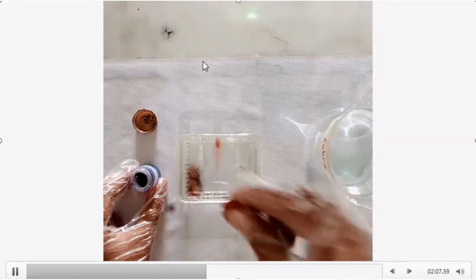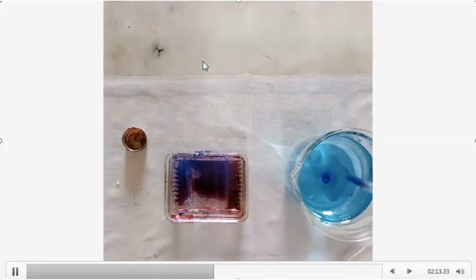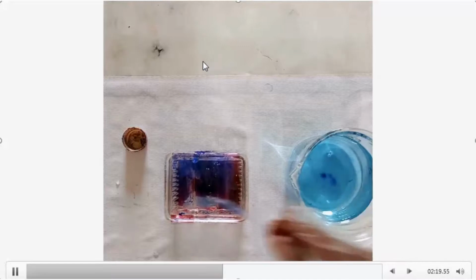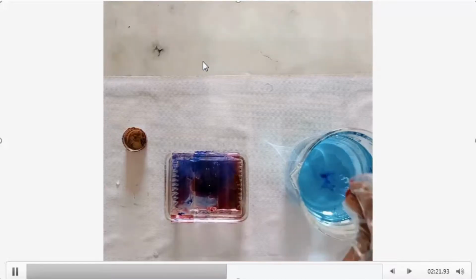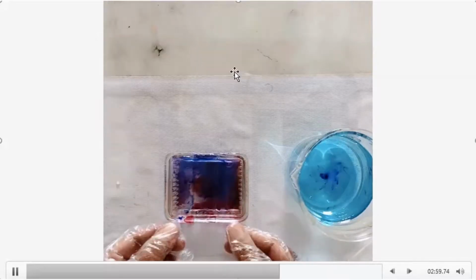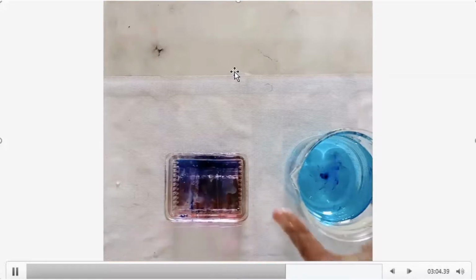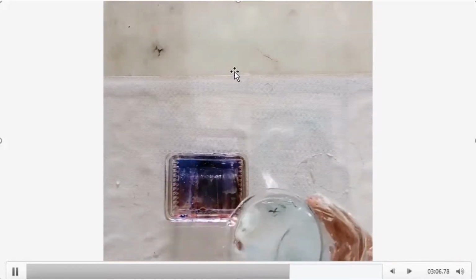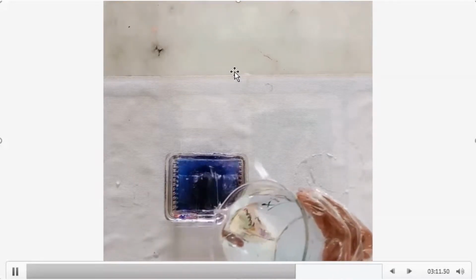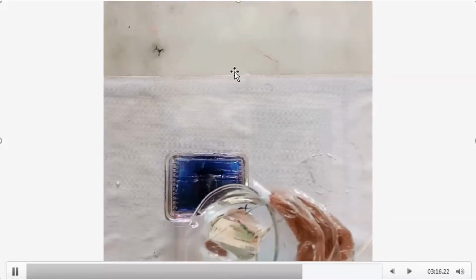So we added stain and left it for 2 minutes, and now we are going to add 2 drops of buffer water on each slide, and then we are going to blow on it in order to mix it so that the stain gets ionized and stains the smear. Now we put these slides in a vertical manner and wash them with tap water in order to remove the extra stain. Wash them thoroughly.